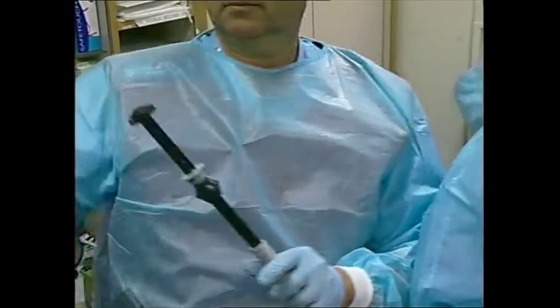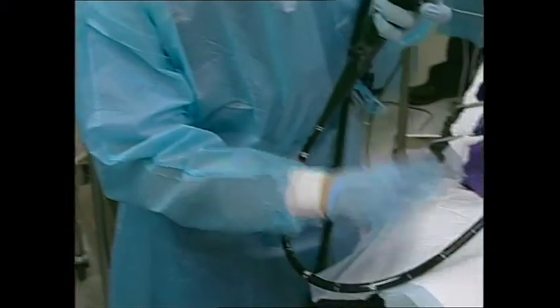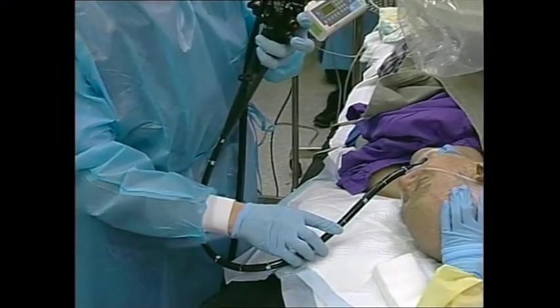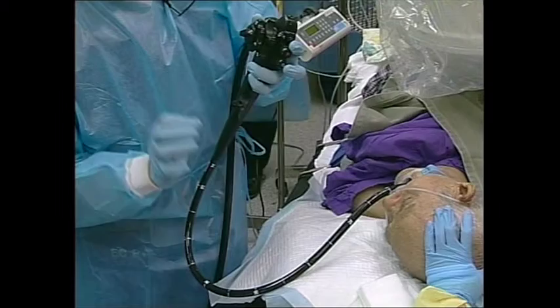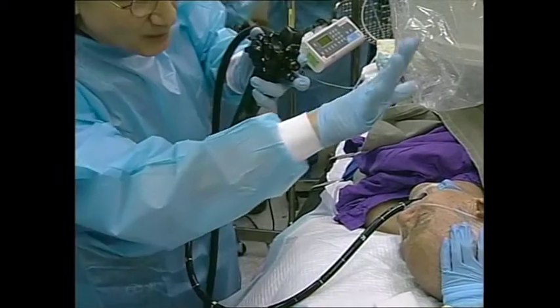Now, one of the things I want to do before we get started is I want to just check my position inside of the bulb, because we want to make sure that we have enough room inside of the bulb to deliver the flange. Can I have an endoscopic view maybe a little bit larger?